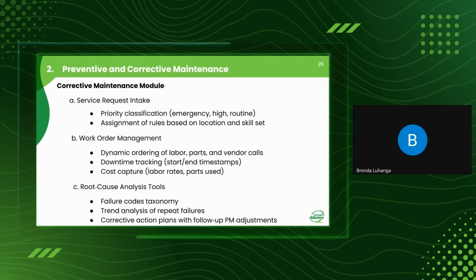So you start with the medical equipment that most departments depend on or are used in emergencies. Then from there you go to the high critical medical equipment. Then lastly you do the routine. You do the corrective maintenance for the routine. That is, you will now consider the list of the equipment that are broken down.